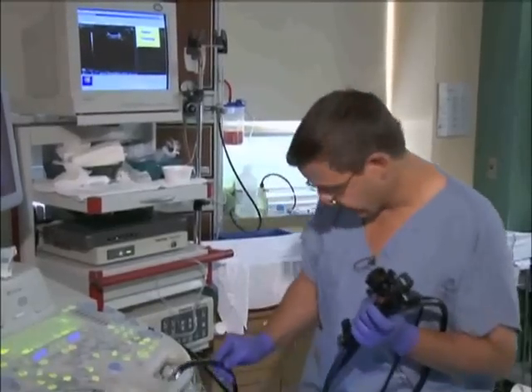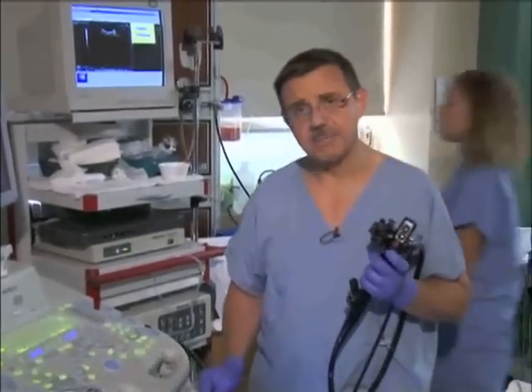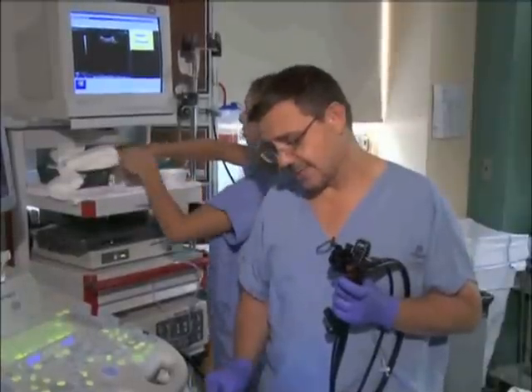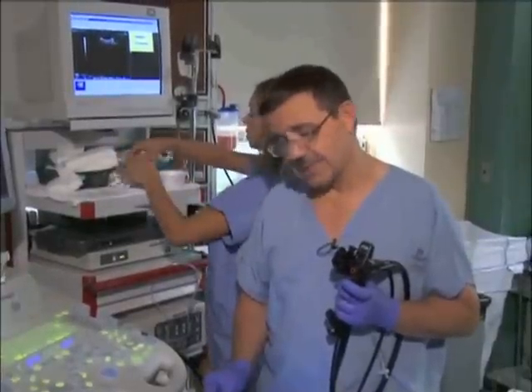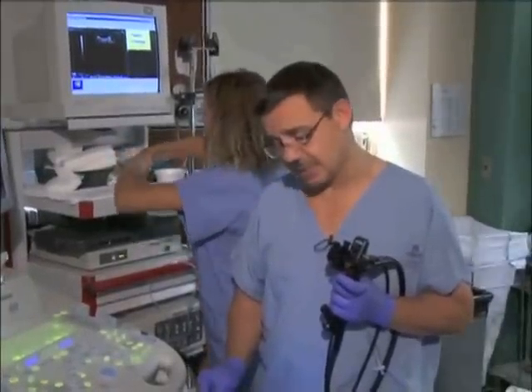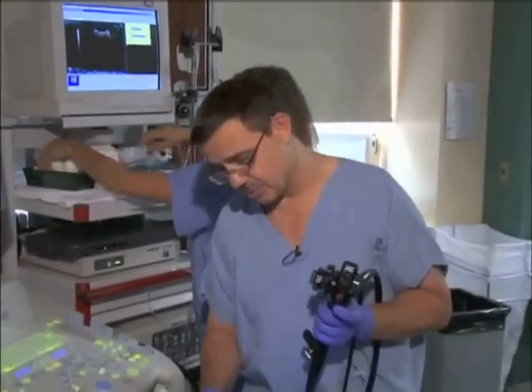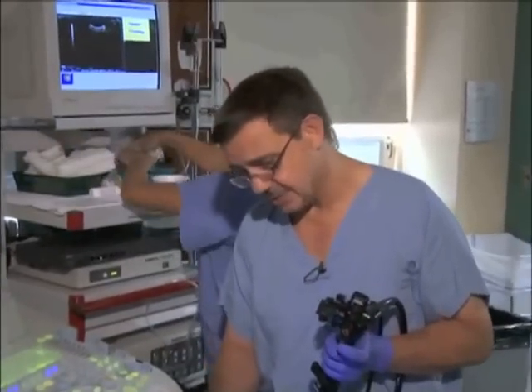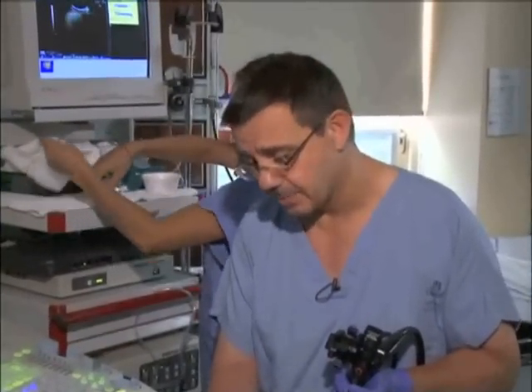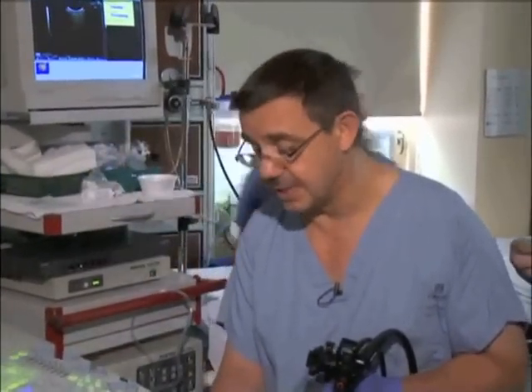This is a case of a patient with a pancreatic mass. She has a plastic biliary stent in place, and now the goal of the EUS is to do the staging and the biopsy of this lesion.